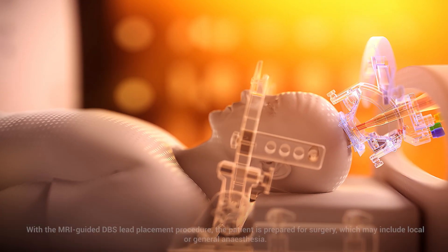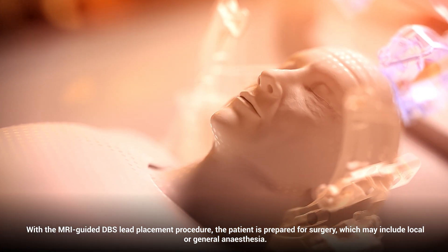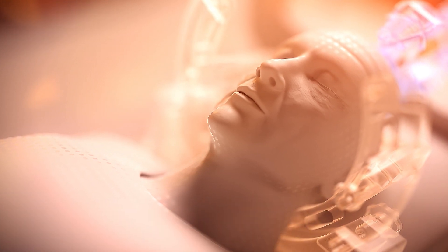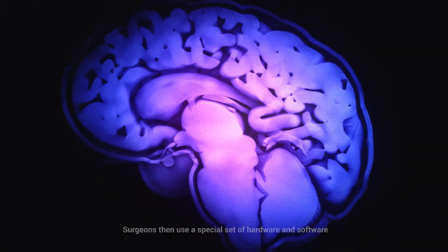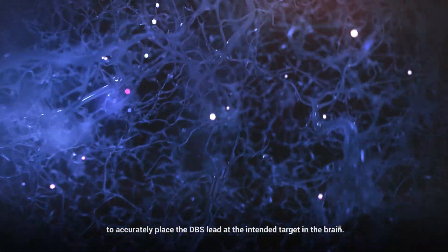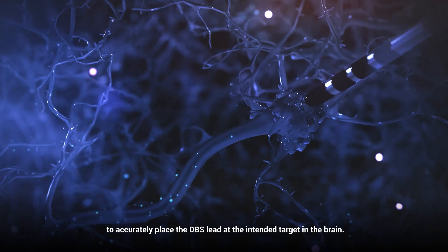With the MRI-guided DBS lead placement procedure, the patient is prepared for surgery, which may include local or general anesthesia. Surgeons then use a special set of hardware and software that is combined with a series of MRI scans to accurately place the DBS lead at the intended target in the brain.